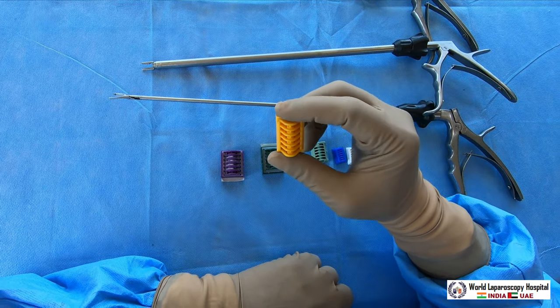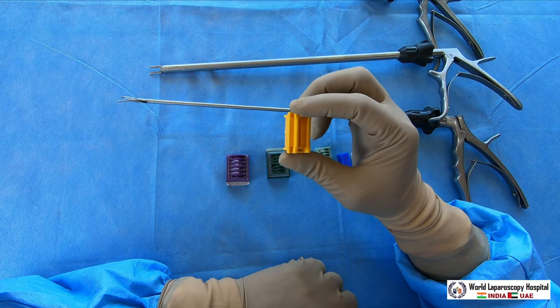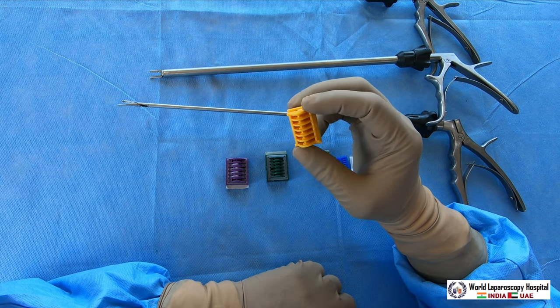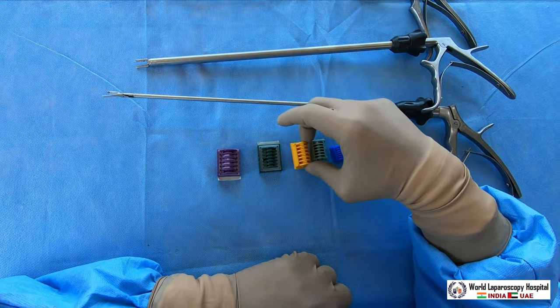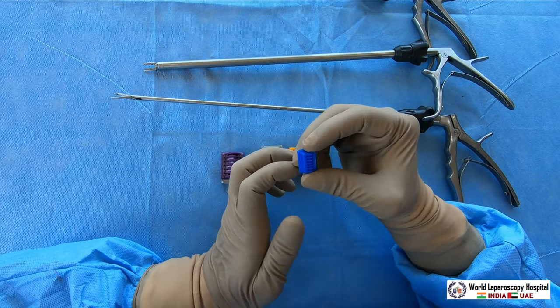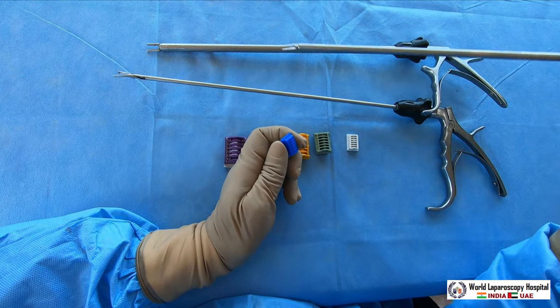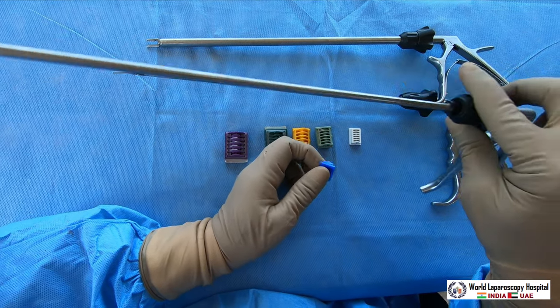Another is the yellow cartridge, which is called the large size. That can be used for structures up to 8 mm in diameter, like the renal artery or splenic artery. You can use the yellow clip. Blue should be used for structures up to 3 mm. The blue also has a 5 mm applicator type, but blue is rarely used.